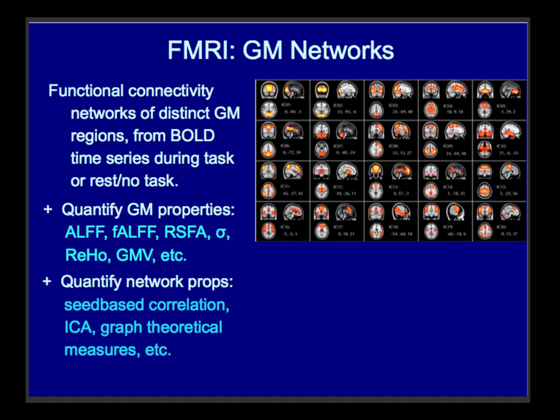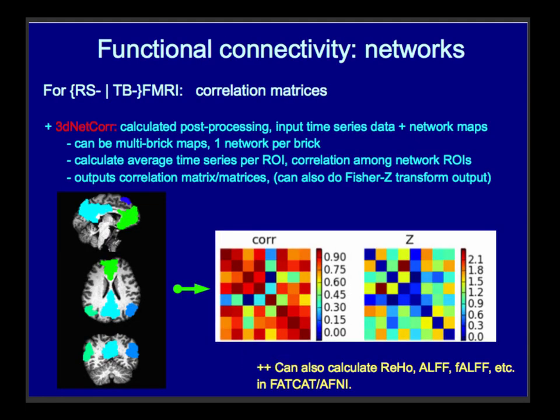And we can think about gray matter kind of hierarchically looking at different properties. We can look at voxel-wise properties, so what is this spot doing, what is this spot doing? Or we can think of network properties. How are these regions interacting, and are they interacting more tightly or less tightly? And how do those change in different pathologies or across development? But there's both a local kind of voxel by voxel side and a network-wide kind of region by region or sets of regions. And so we can use things like simple correlation.